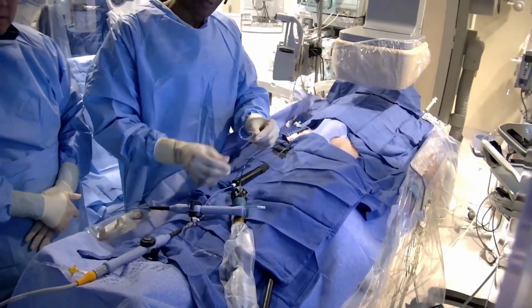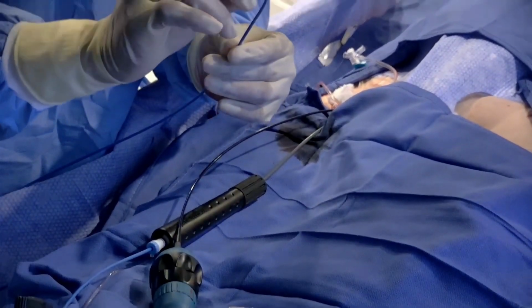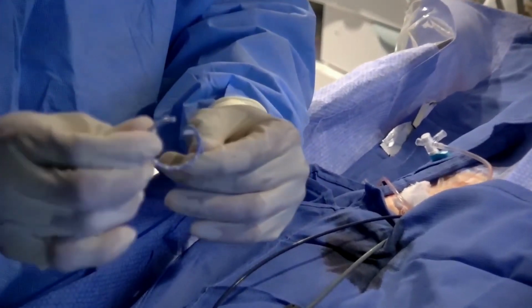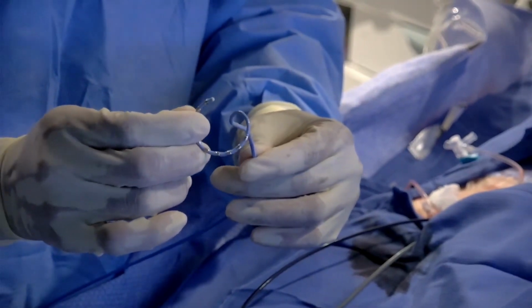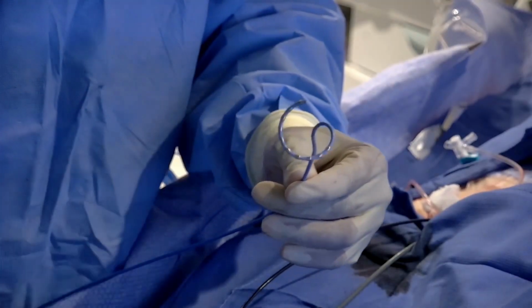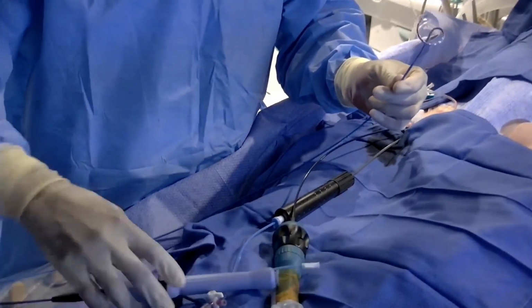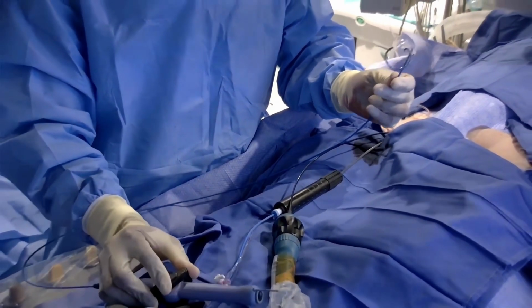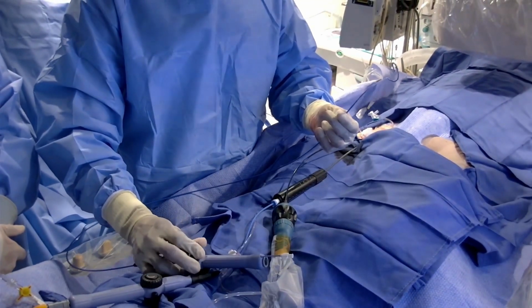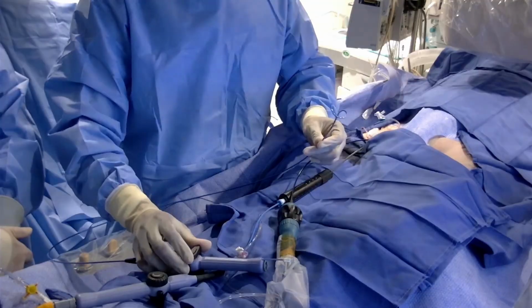As you can see, it's a variable loop catheter. It's kind of the shape of a pigtail, a little bit different than the Pulse Select, which is flat. And as you can see, the electrodes are 3 millimeter electrodes, and there are 10 irrigation ports, so each is individually irrigated, with 7 millimeter spacing. The catheter is deflectable in one direction to 90 degrees, and then also to 180 degrees. I can tell you that I usually don't use the deflection much. I basically use the external sheath to do any of the manipulation of the catheter.